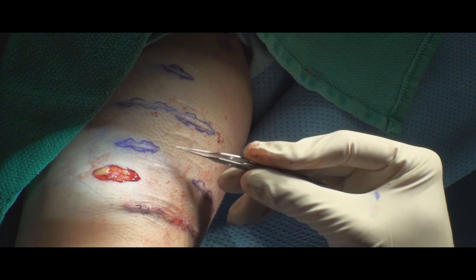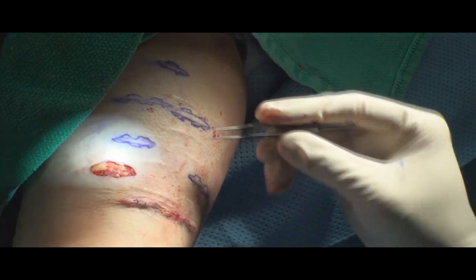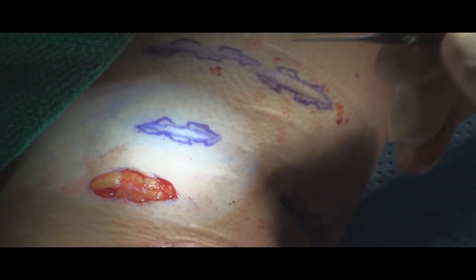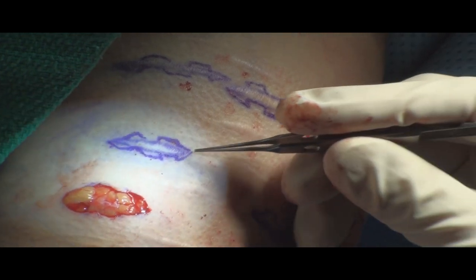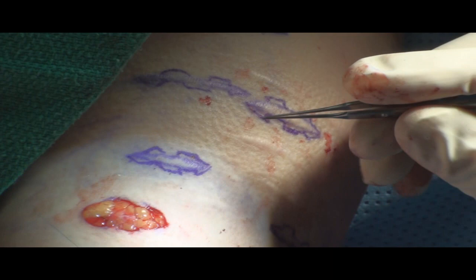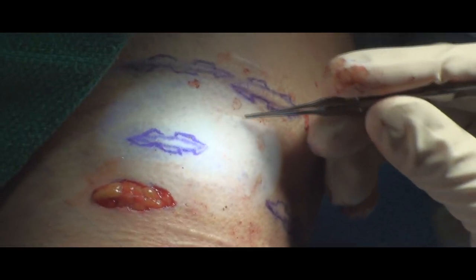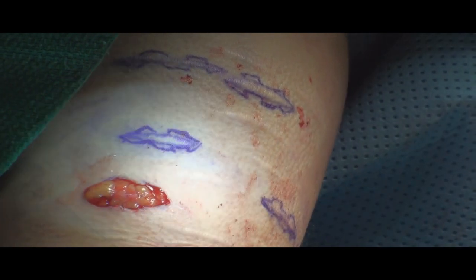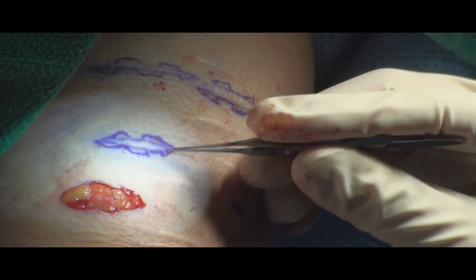So there's a principle behind us doing a few of these in order to decrease the tension in general on our closure. What I'm demonstrating here is there is a scar here that's in the shape of a sort of a fusiform type of shape. But we have drawn in the outer margins of the scar a pattern. This is called a geometric line closure pattern. The principle behind this is that the human eye sees any line that's greater than 0.7 centimeters. Any line that's longer than 0.7 centimeters, a person will see or notice a pattern, so anything longer than that needs to be broken up.